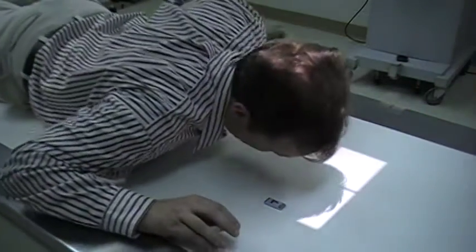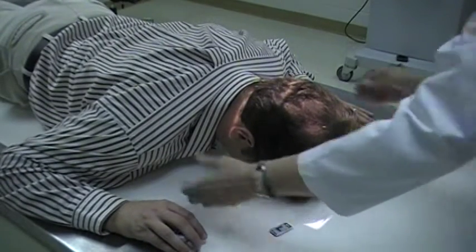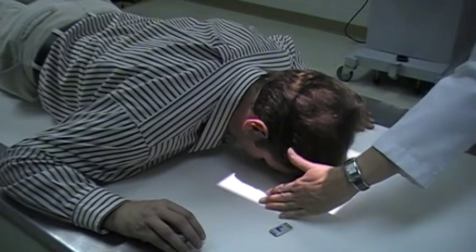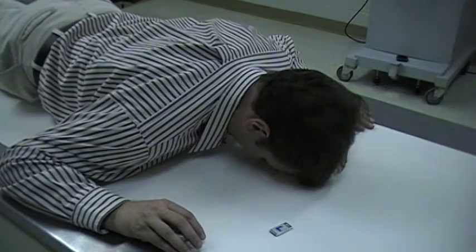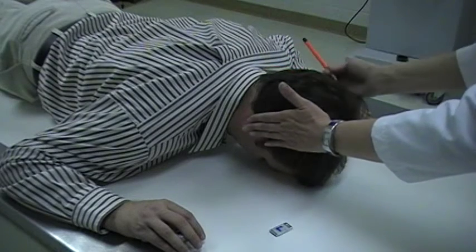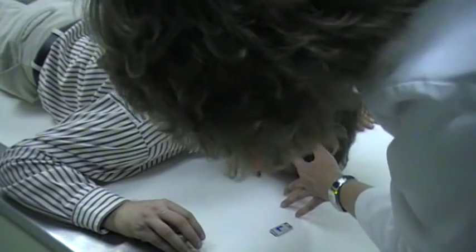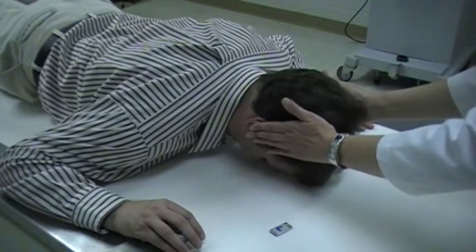So he's going to put his forehead and nose up against the table. And I'm going to scoot him over just a tad to get him more central. Okay, and then check that the forehead and nose is touching. Make sure that the head is not rotated, because you do want that mid-sagittal line straight. And you want to check and make sure that the orbital meatal line is going perpendicular to the table.